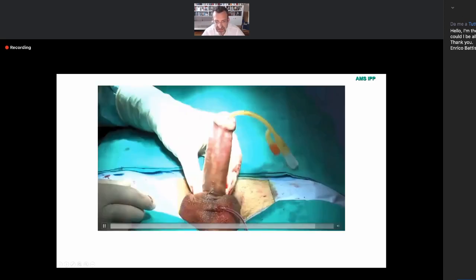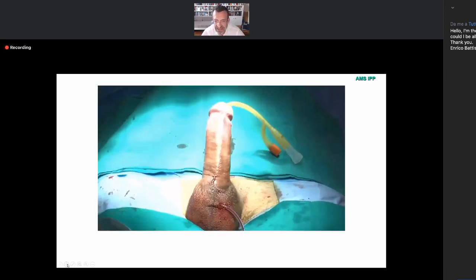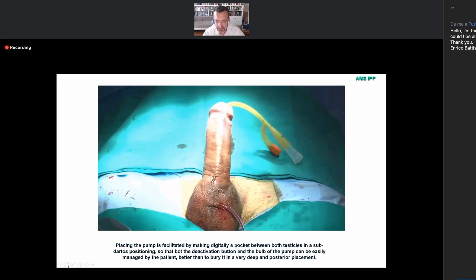Recently, I have almost always given up leaving a drain, and no problem has occurred. And this should be the final aspect. In relation to the postoperative questions, this should be very easily managed.